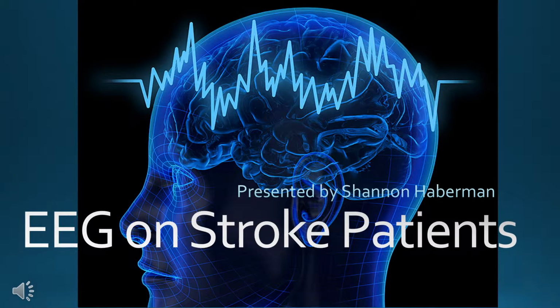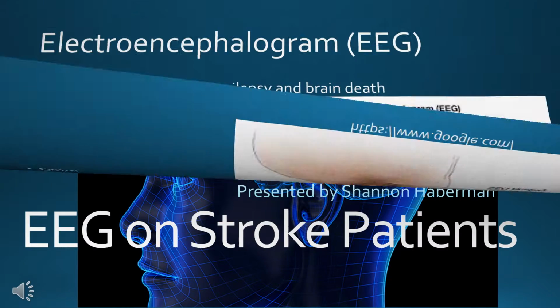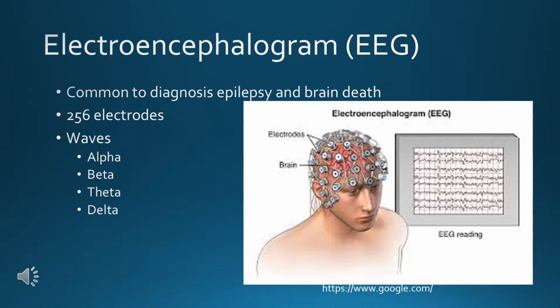Today we're going to talk about EEG on stroke patients, presented by Shannon Haberman. The electroencephalogram, or EEG, is a diagnostic tool that is used to help diagnose epilepsy and brain death.